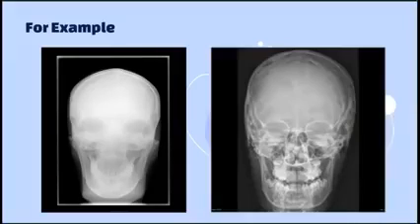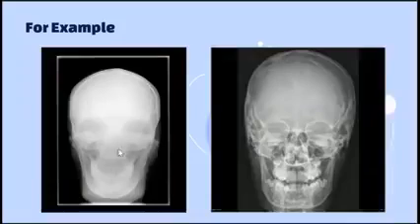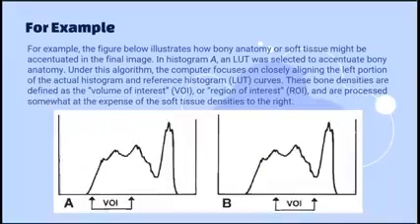So if the same radiograph is processed using a soft tissue algorithm, the region of interest will be the right region of the bell curve, representing tissues from dense organs to skin. If the processing is the same but focused more on soft tissues, again, this is how it will look.